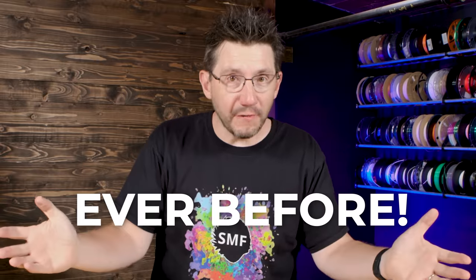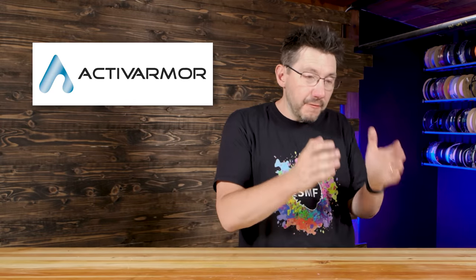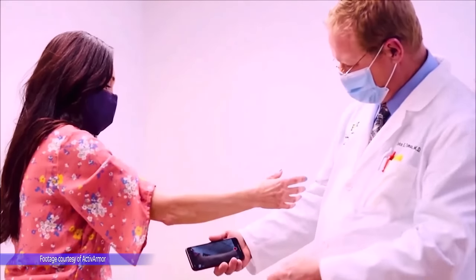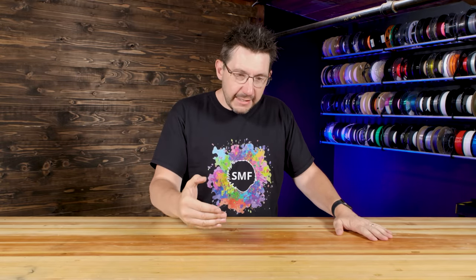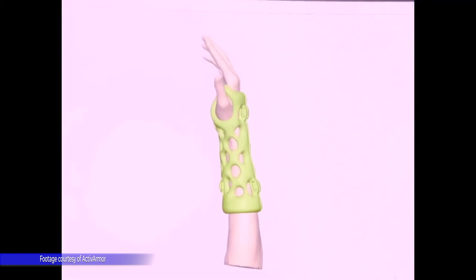3D printing is being used in the medical field more so than ever before. A company by the name of Active Armor has created a free app that allows you to scan the hand, a wrist, an ankle, and then it creates a cast in CAD for the part you've scanned.